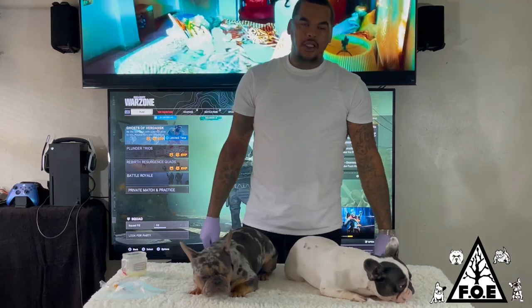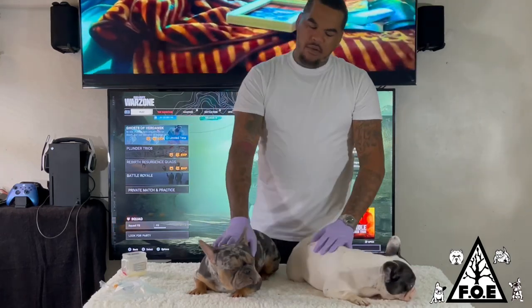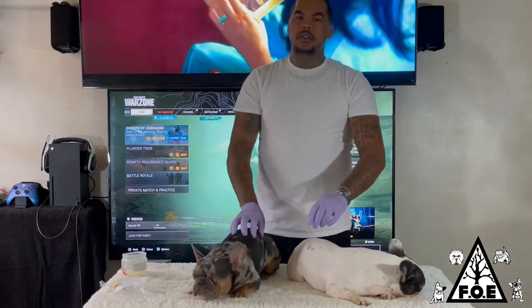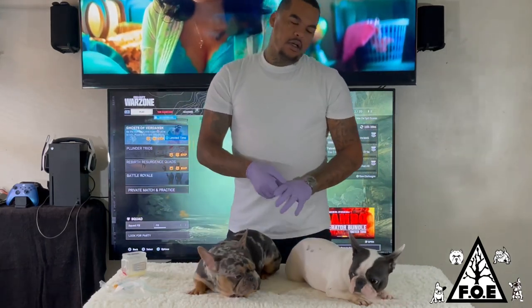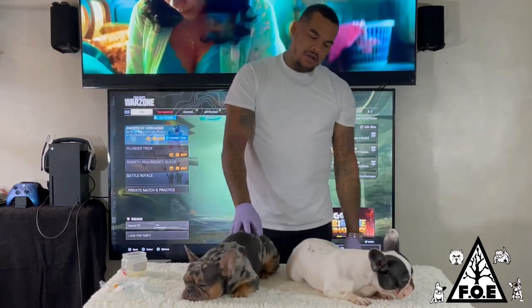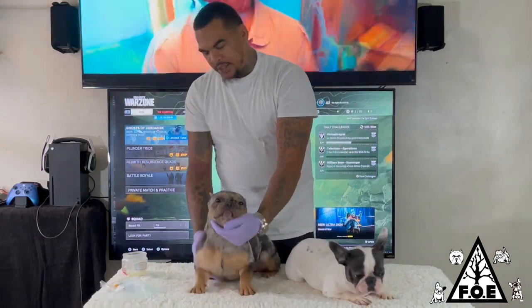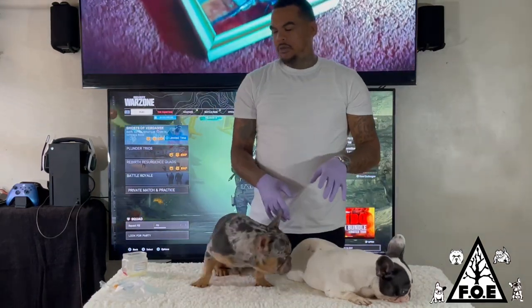What's up y'all, got my two Frenchies here. My girl Lola just went into heat about a week ago, so I'm about to do this AI with my boy Draco. This is the first breeding for both of them. Draco's about 11 months, Lola's about 16-17 months. She just went into heat. I've done two AIs already — this is gonna be my third one. Today I'm gonna show y'all a little bit how I do my AIs.